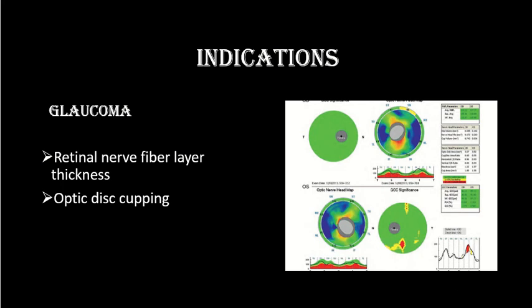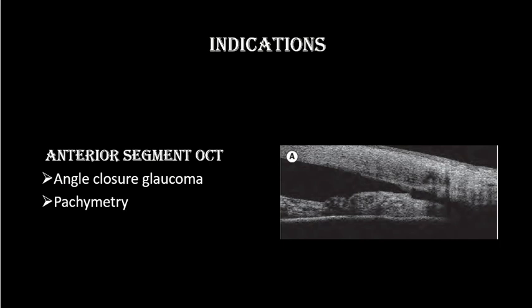These are the different indications for OCT — to diagnose macular lesions and glaucoma. OCT can also diagnose angle closure glaucoma and can be used for pachymetry before and after different kinds of refractive surgeries.